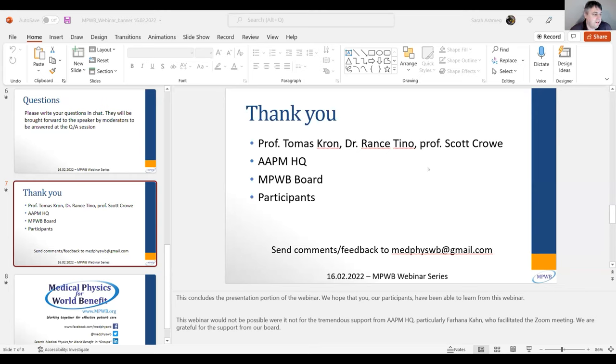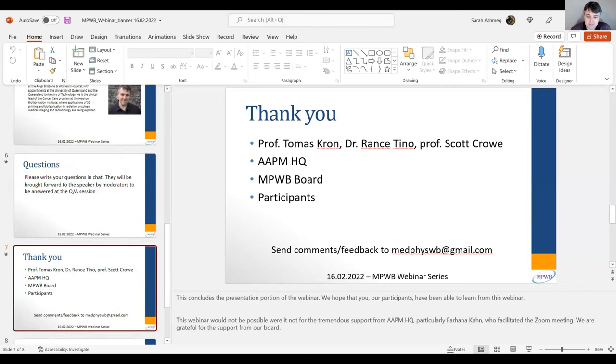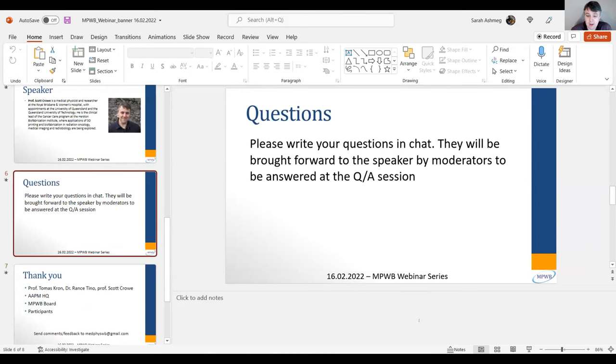I would just say that one of the things that we very frequently print is not necessarily a full head phantom, but we might print an insert for a CIRS head phantom. So we augment or supplement our commercial phantoms with 3D printed pieces. I think that's a really nice solution. I don't know what CIRS and those other companies might think of it, but it's very useful as a department. I think Scott is perfectly right. This is about complementing each other rather than competing. Nice, thank you.